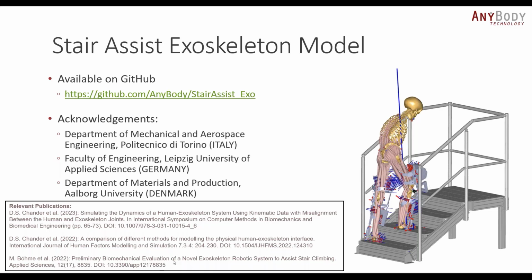Here you can see some list of publications where you can read more about the modeling aspects, as well as if you are interested in reading about the outcome of this exoskeleton and how the exoskeleton works, you have a link to one of the publications here.